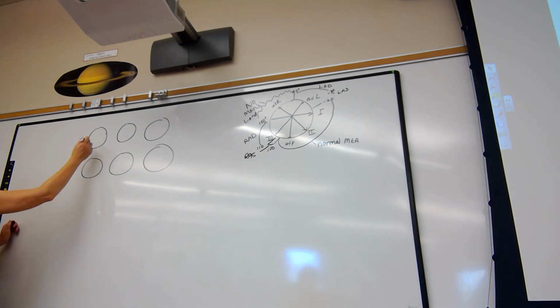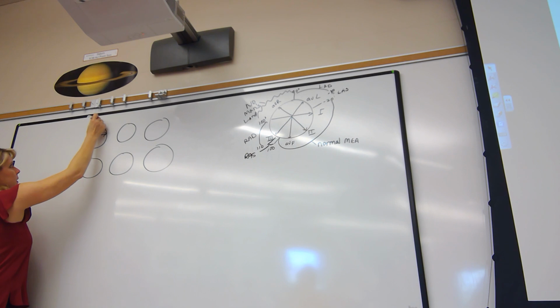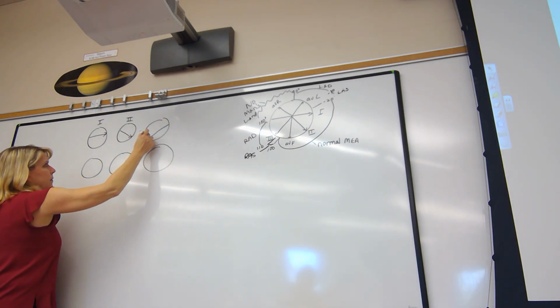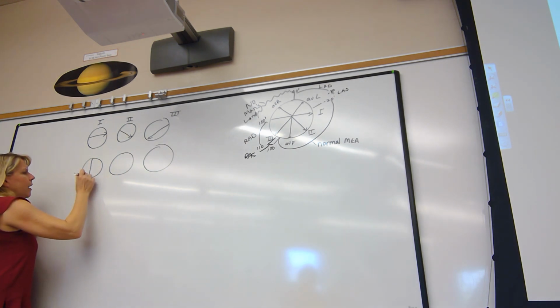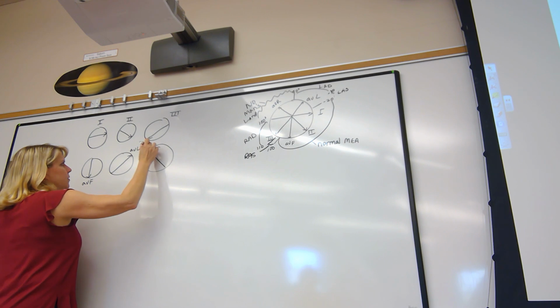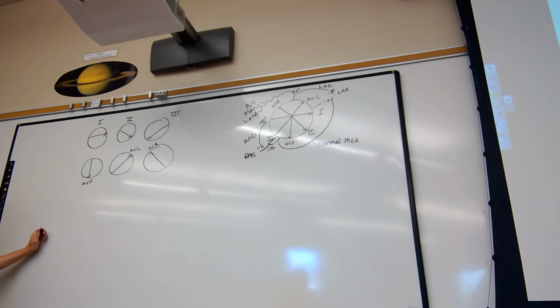For example, here's lead 1. Here's lead 2. Here's lead 3. Here's AVF. Here's AVL. And here's AVR. You should be able to do that on your own by Tuesday.